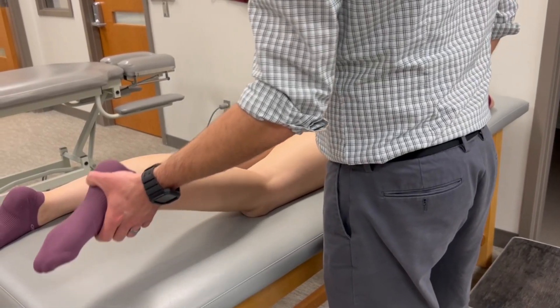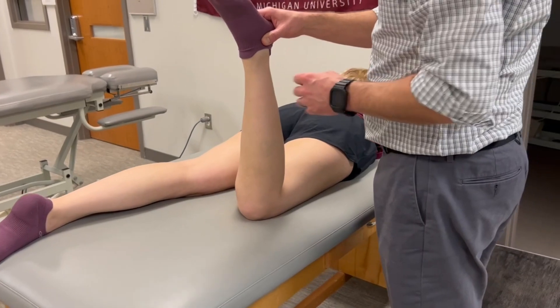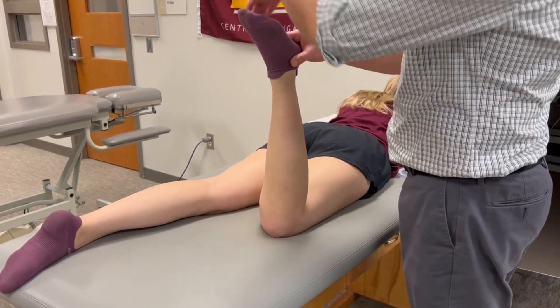Hip external rotation, passive range of motion. Our zero position — we're going to use the anterior midline of the leg as our indicator. That's going to be parallel with the line of gravity.